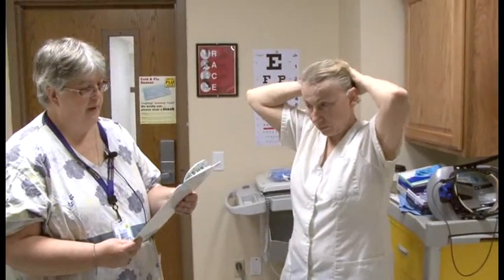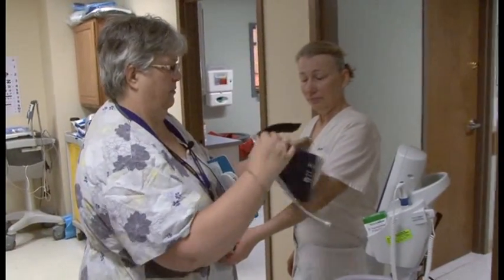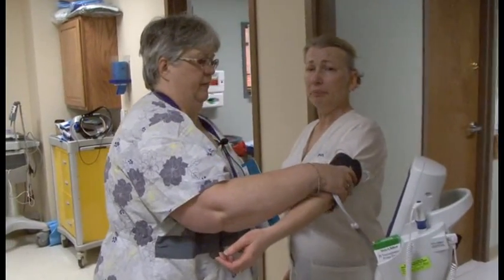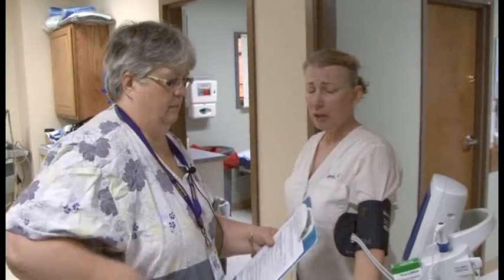Once Lynn gets her hair up, I'm going to take her vital signs and record them. The purpose is to get a baseline in case she becomes overheated while in the room. So it's just going to be temperature, pulse, respiration, and blood pressure.